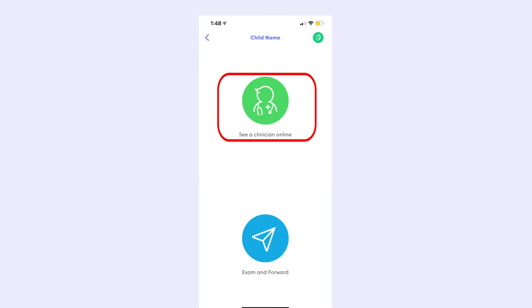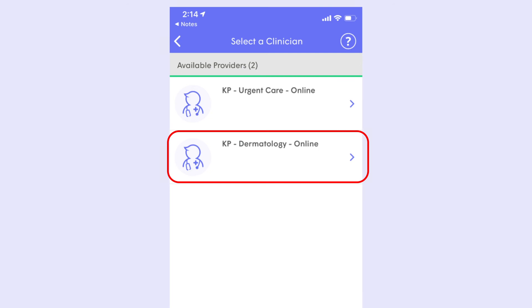Then select Your Clinician. Once you click your provider, a virtual waiting room will appear on the screen. Continue waiting in the virtual waiting room until your provider appears on the screen.